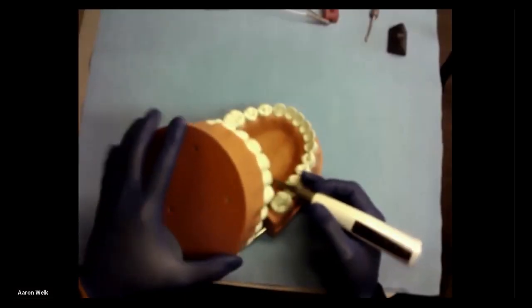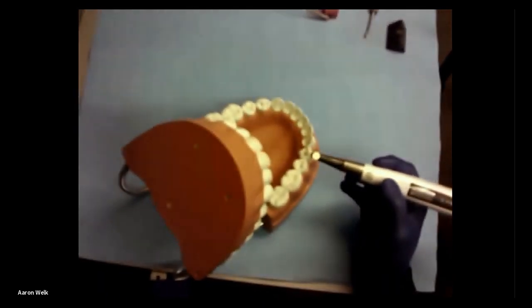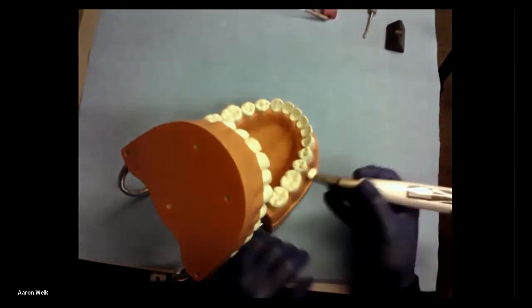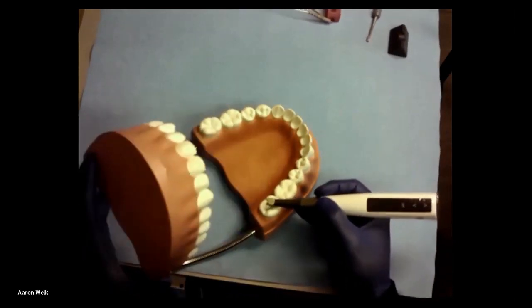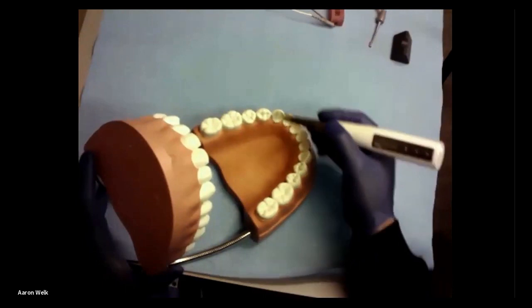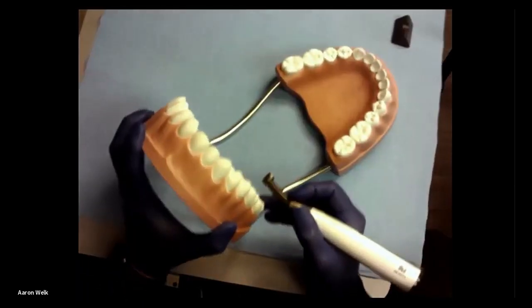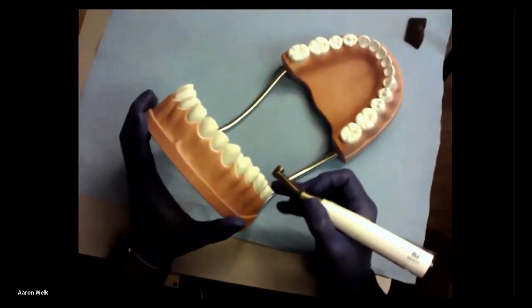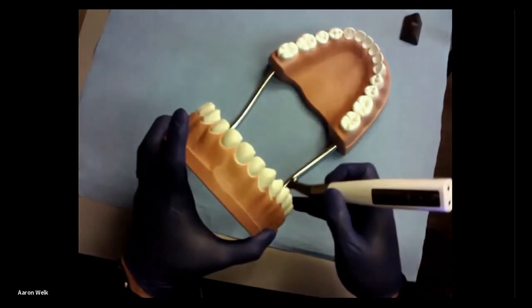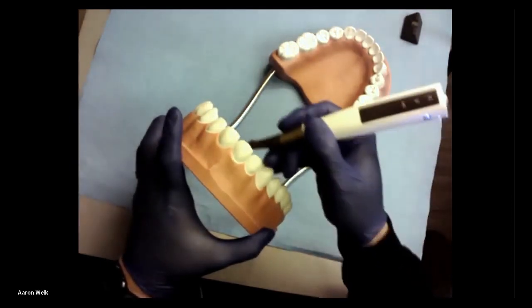One thing I like about this handpiece is I can reposition and change the contra angle in any direction. If I'm working on a mandibular tooth, I use my thumb to activate and have easy access into the canals. When working on a maxillary tooth, I rotate the handpiece so my thumb is activating from a different position, giving me a finger rest so I can reach most upper right maxillary teeth.